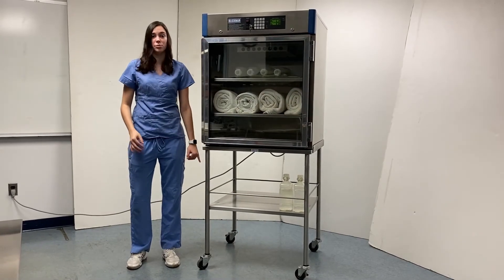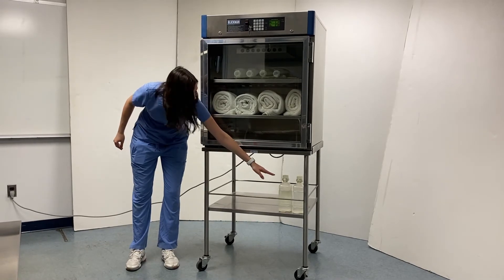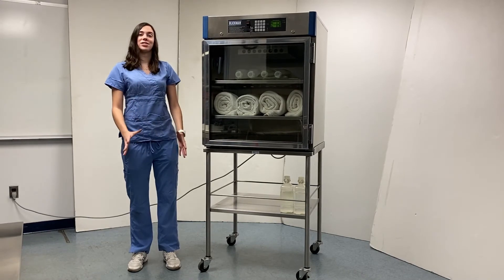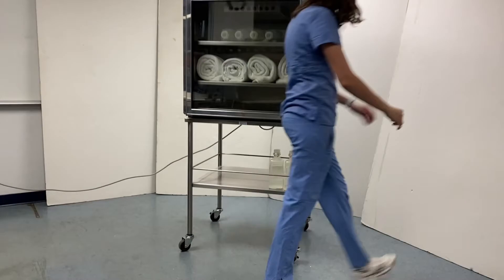Additionally, it features a bottom shelf with four guardrails to securely hold goods, as you can see right over here. This mobile stand has four casters, two of which are locking.